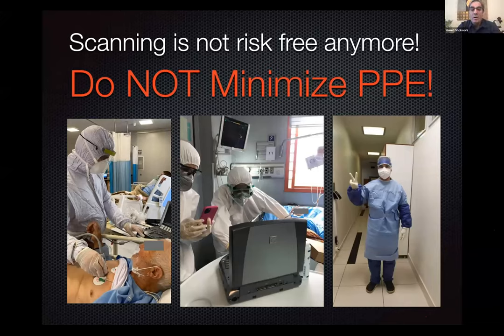Be careful. As you can see here, this is our team and the team at Tehran University, Iran University. They are very well prepared when they are scanning this patient. Do not minimize PPE. PPE is necessary for all these cases.